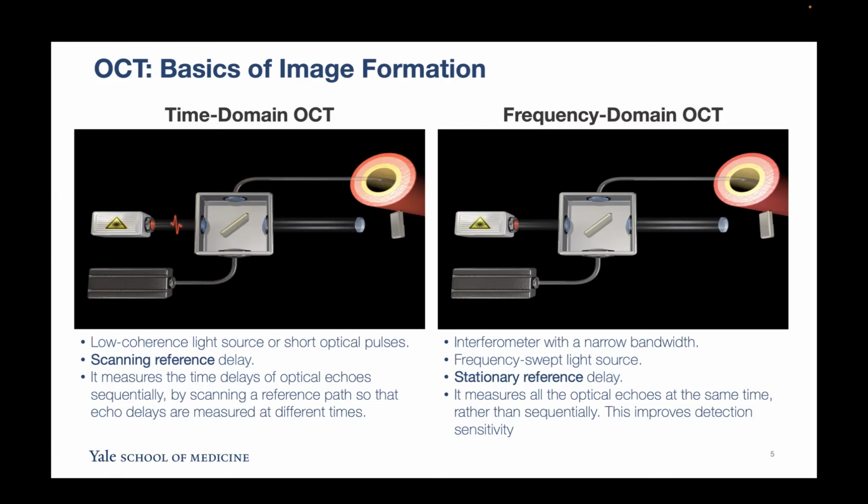The maximum they could get was up to 3 millimeters per second. So there was a need to occlude the vessel proximally and flush with saline, and the acquisition was done under saline flushing with a balloon occlusion in the proximal segment. This is the system I started using when I did my training in 2007 and 2008, and it was really painful for patients and really annoying to see those ST elevations while I had some seconds of balloon occlusion in the coronary.